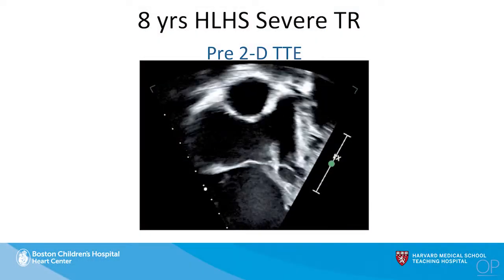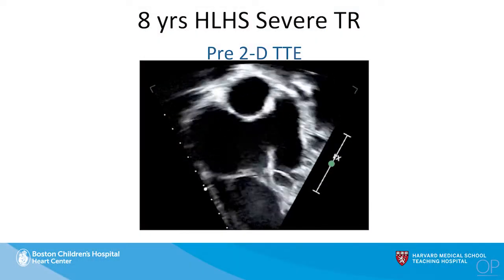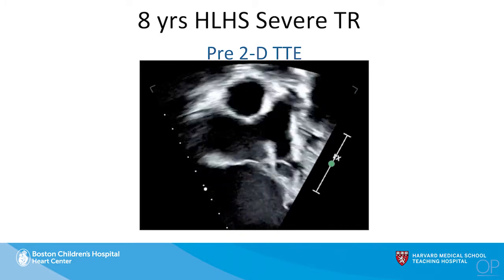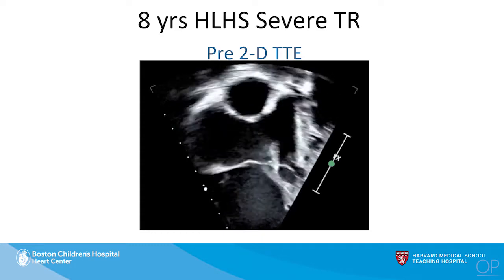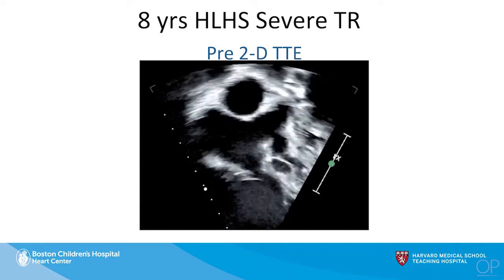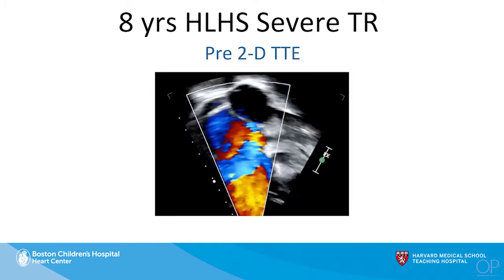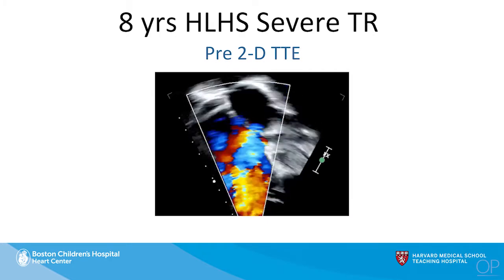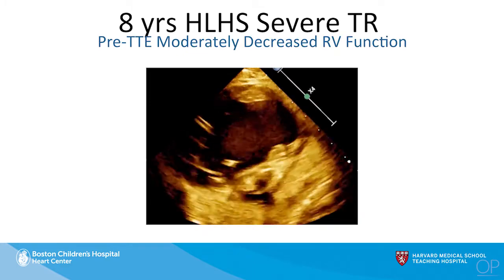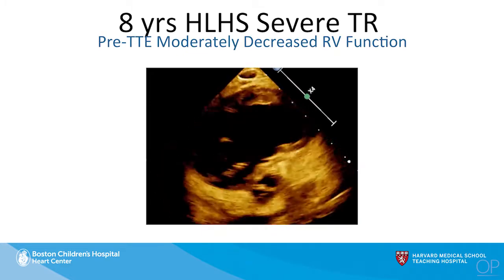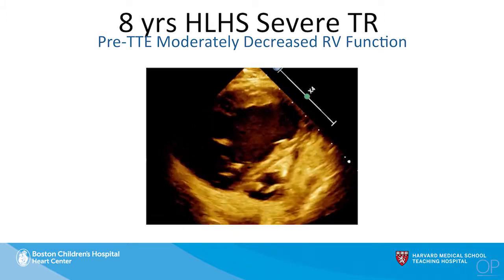Here's a typical two-dimensional echocardiogram, and you can all appreciate what really looks like prolapse of the anterior leaflet — that's what this patient was thought to have. Clearly, we can all see the very severe tricuspid regurgitation. The RV was significantly dilated and dysfunctional qualitatively by this two-dimensional imaging.